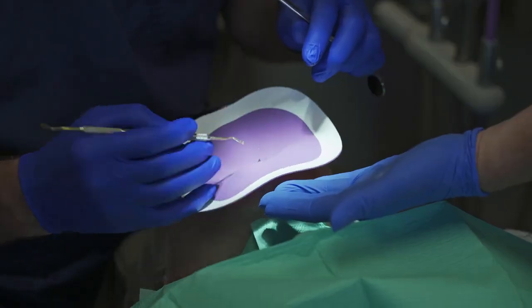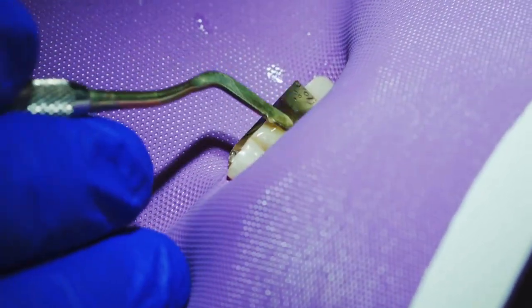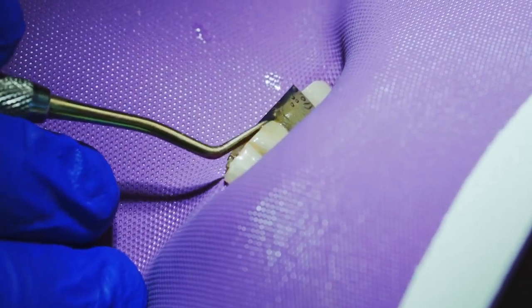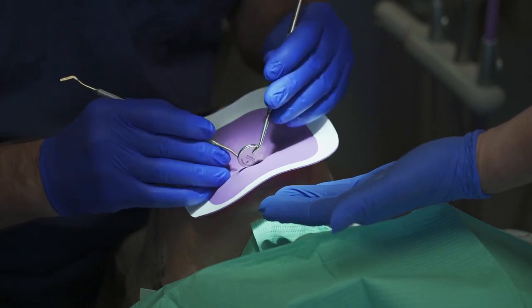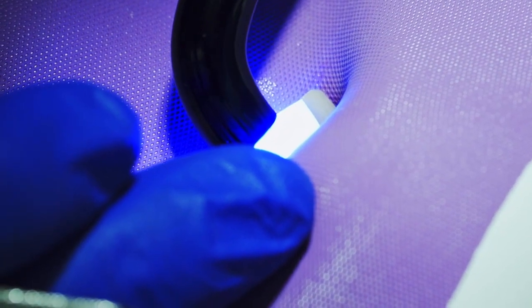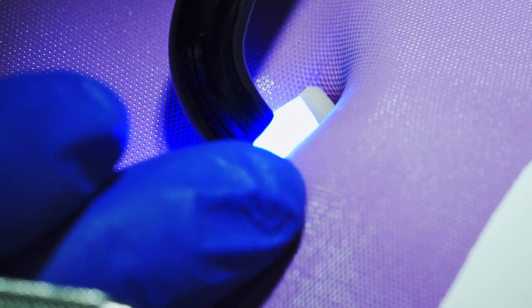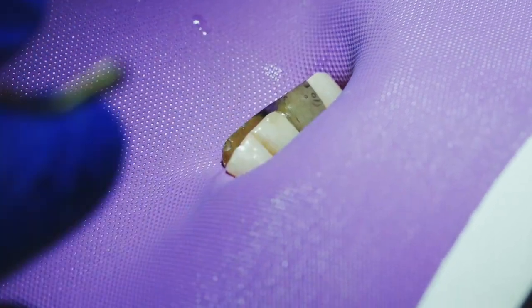I've used multiple glass pins to act as scaffolding to rebuild teeth. This product has a 10-year track record in my office, and I have them in about 160 different patients over the years. This is also an amazing product for wear facets, especially in the molars where you have dished-out enamel with exposed dentinal tissue — you insert this right in the center and build around it, and they just don't fall out.